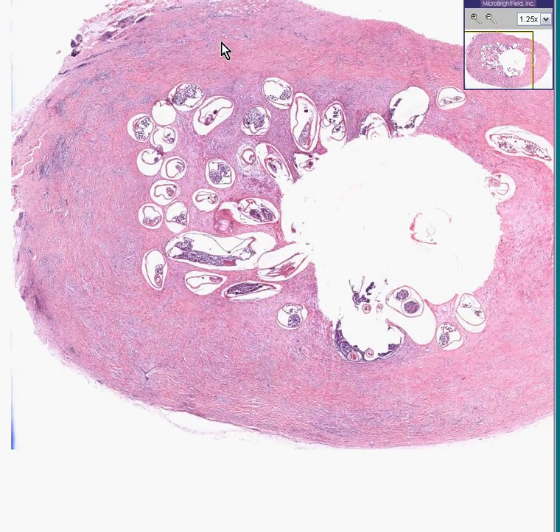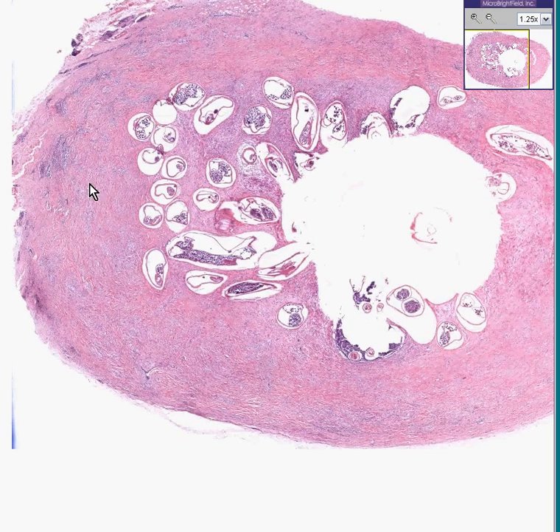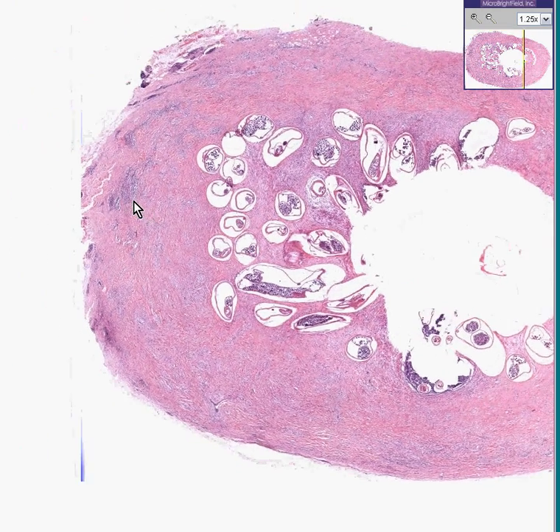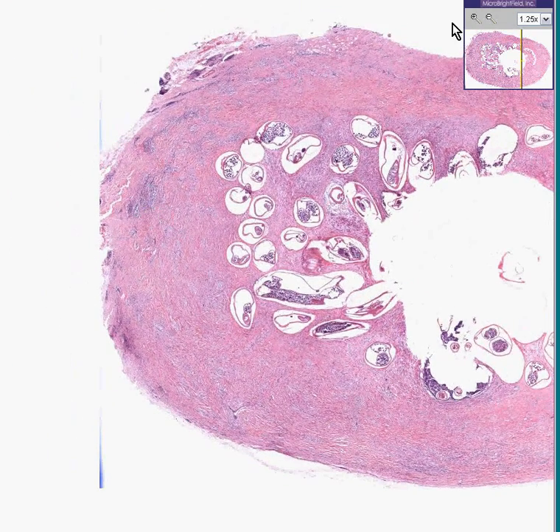You're dealing with areas of a lot of fibroblasts, a lot of collagen, making up most of the pink wall of this area.